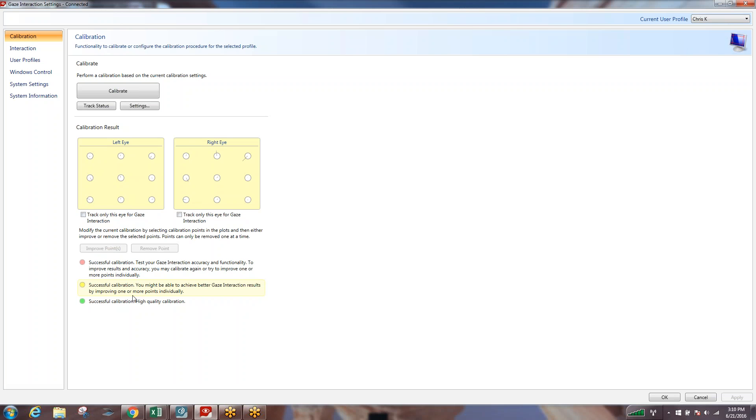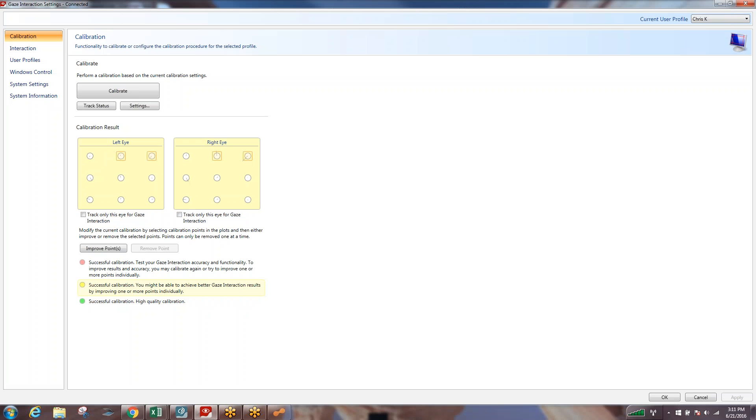I'm going to concentrate a little bit harder. I still didn't get a dialed-in green calibration — I have a yellow calibration. Now, yellow, green, or red — they are all still successful calibrations, so please don't get too hung up on the color. All it's telling you is that there may be areas where we could tighten things up and get a little more precise. I'm going to try and improve those two points again, and it took me to a green calibration. This means I'm probably going to be pretty precise with my calibration and my ability to access smaller targets on the screen.